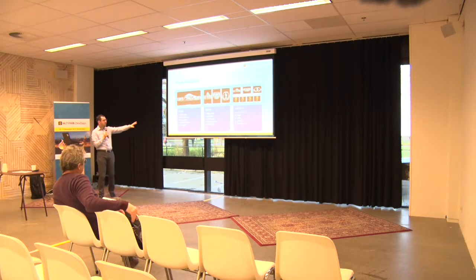So once again, there's a hierarchy here. And then at each level, we've got some very interesting attributes. This is a very short-handed list here, just to show. And basically, the most important thing we want to look at is the UID. So you see study UID, series UID, instance UID. That's DICOM terminology, basically, for unique identifier. And keep in mind, the last one, we've been talking mostly about images, but here we're calling it instance. This is the more correct term because the instance could be anything. It may actually be an object that you could show, but it may actually just be a metadata object. For example, like when we talked about key object or GSPS, things with markup, so it could be something invisible.